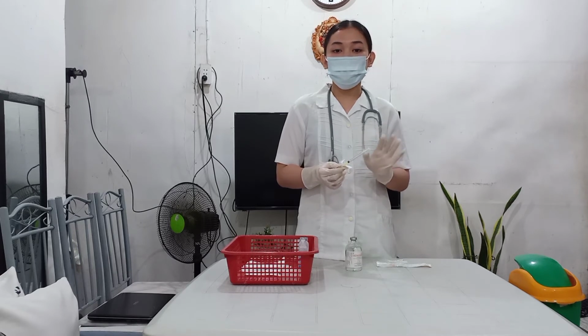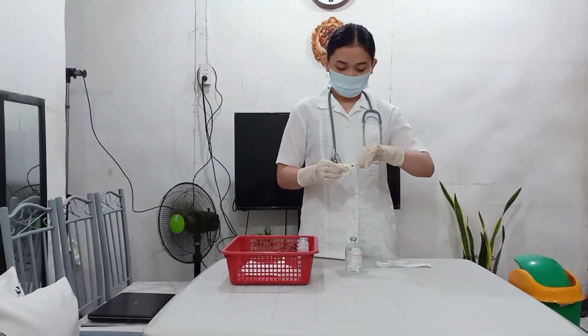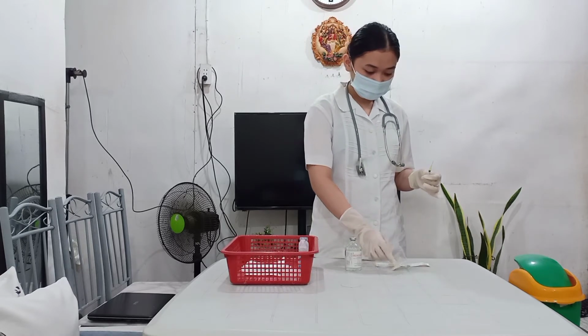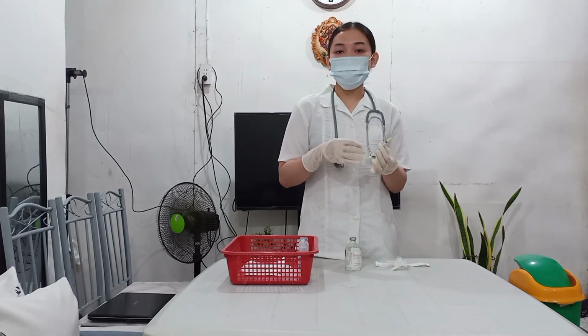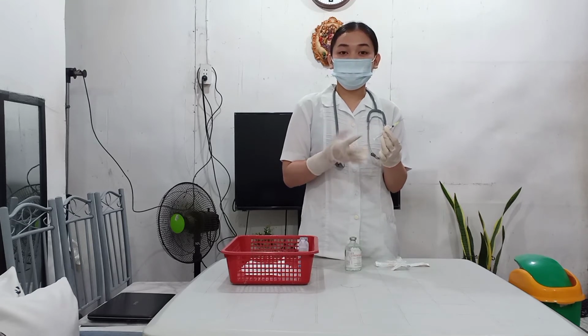If not enough air is injected, the negative pressure makes it difficult to withdraw the medication. So, assuming that my doctor ordered me 1 ml of medication, I will draw also 1 ml of air.